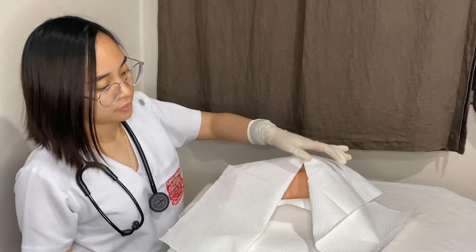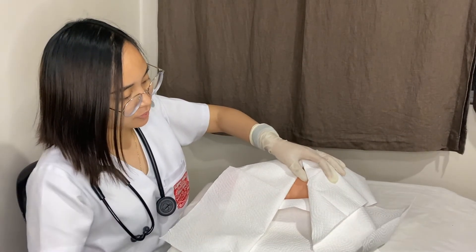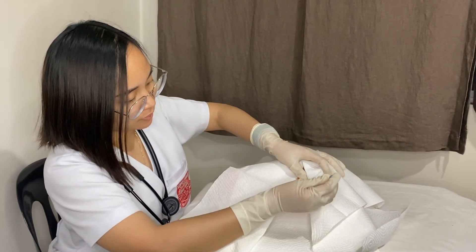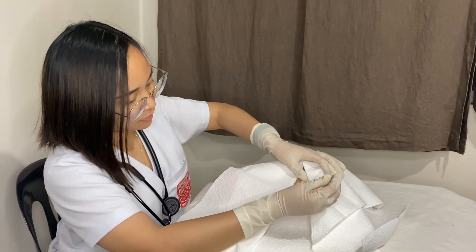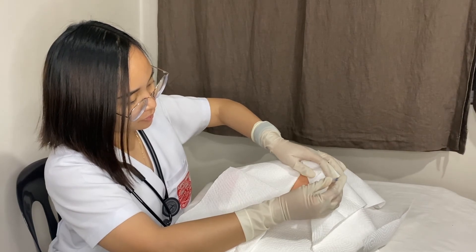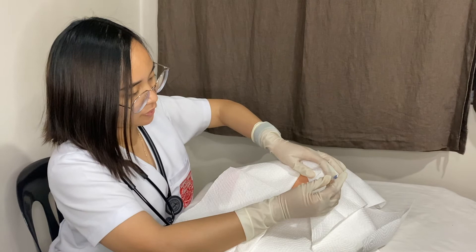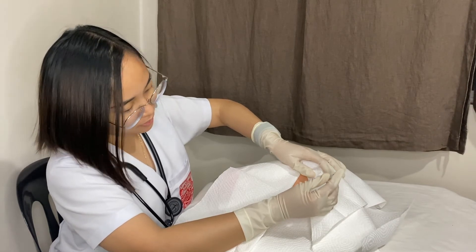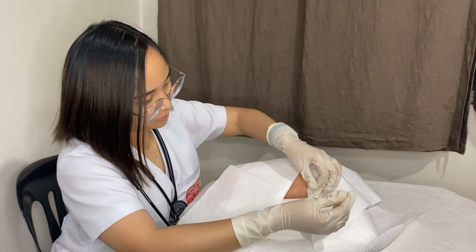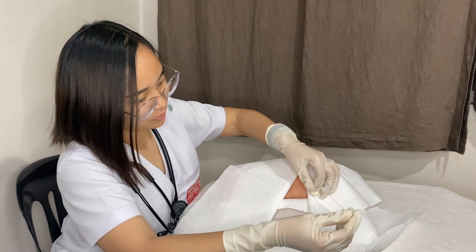Stabilize your dominant hand on the baby's sacrum and aim towards the umbilicus. You should aim towards the umbilicus so that you can pass between the spinous processes, because if you go in perpendicular to the skin, you are much more likely to hit bone. As you move the needle in, you may or may not feel a change in resistance, often called a pop. Periodically take the stylet out and see if there is CSF flow.